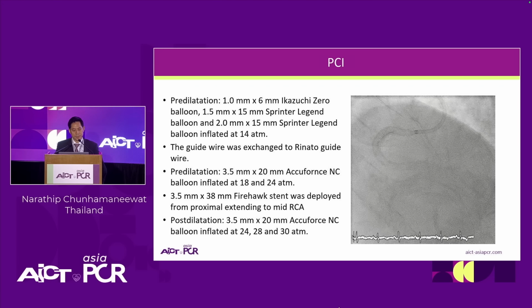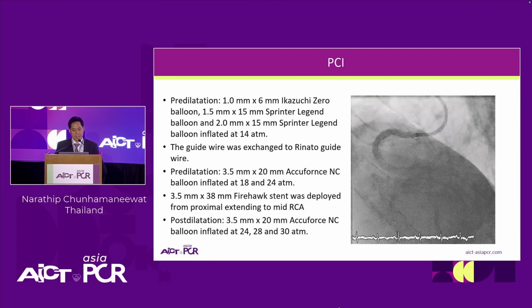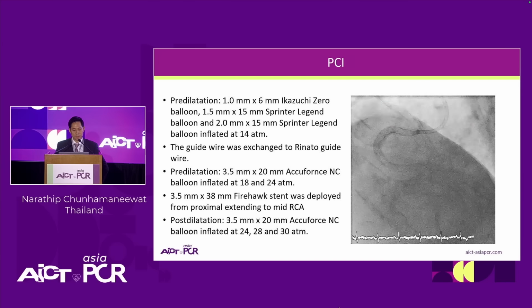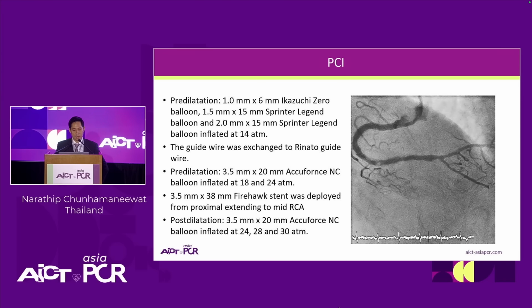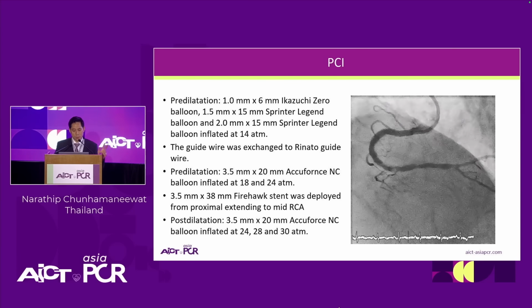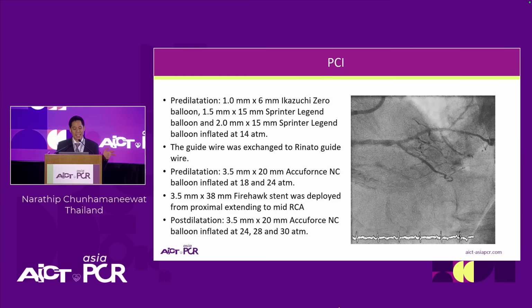I did step-by-step predilatation and placed a 3.5x38 drug-eluting stent proximally and did post-dilatation with a 3.5. So at that time, drug-coated balloon was not available in Thailand yet.